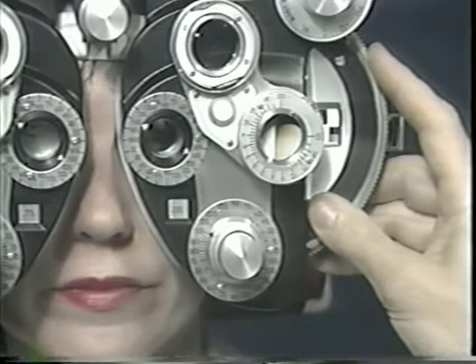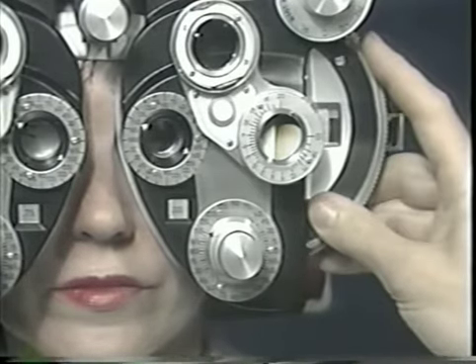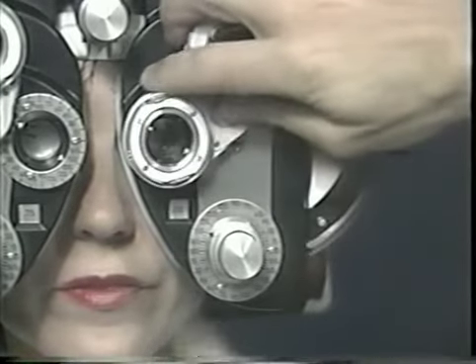TZVECL. Okay, one more time. Better or just smaller and darker? Ready? There. Just smaller and darker. Good. Now, I'm going to give you a choice.